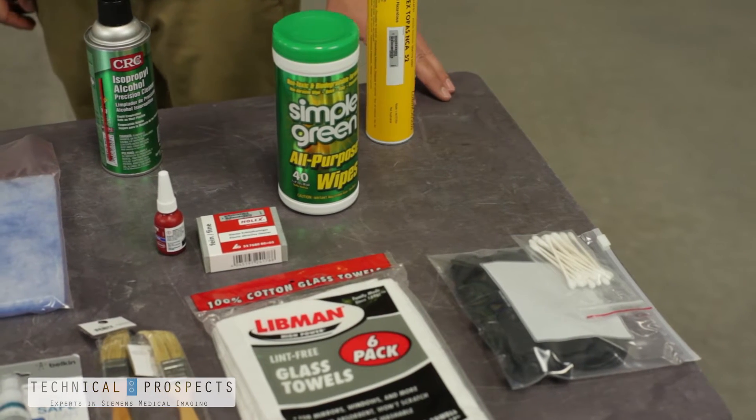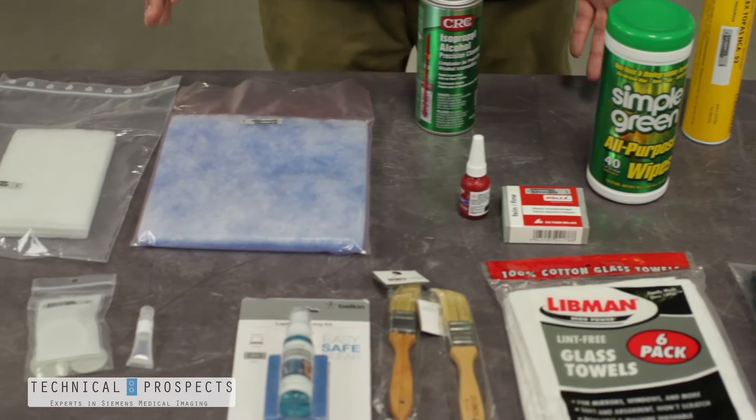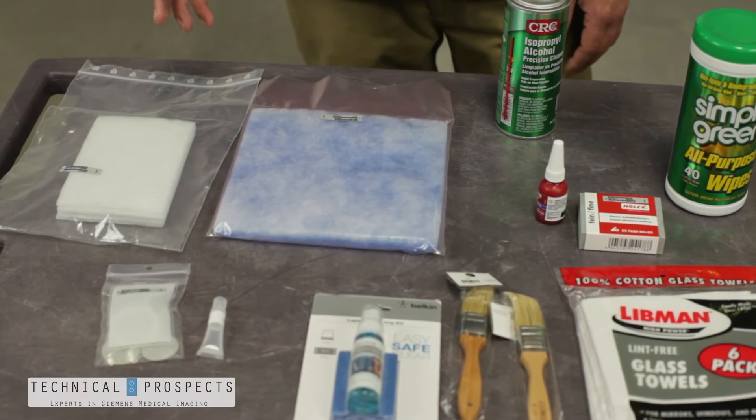When you receive your kit from Technical Prospects, you can expect to receive all the cleaners, greases, and supplies needed to complete your preventative maintenance on your Siemens CT scanner.